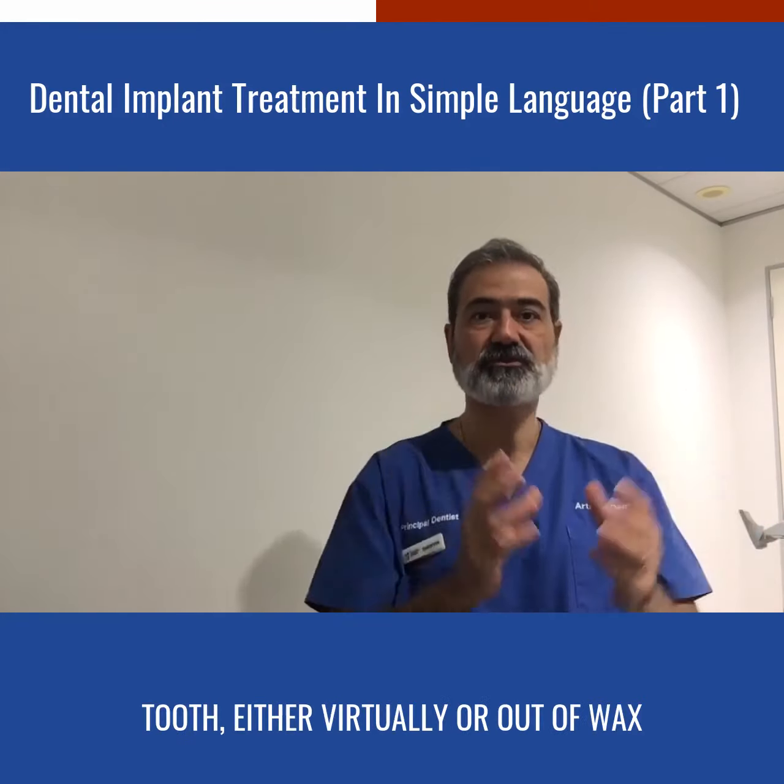On appointment number 2, or second consultation session, dentist needs to have a chat with you about possible options, and the options could vary between individuals depending on the amount of bone in the area, the number of teeth being replaced, your systemic conditions, the quality of your bone, and many other factors. So implant treatment is not like one size fits all thing.